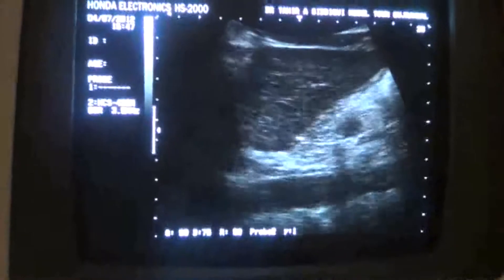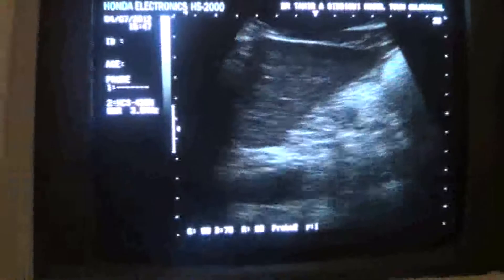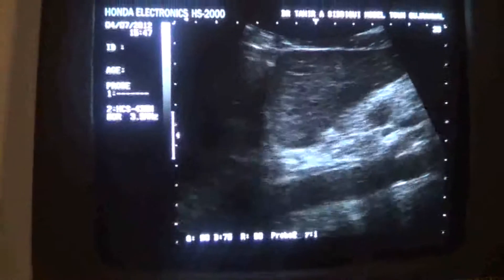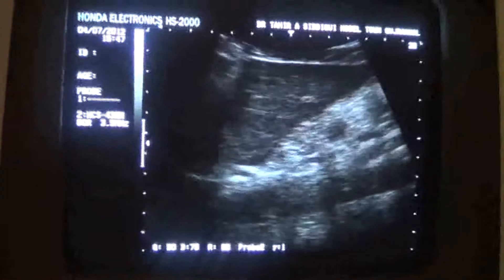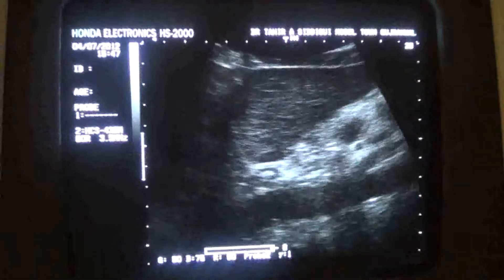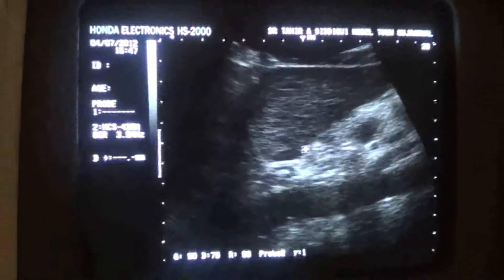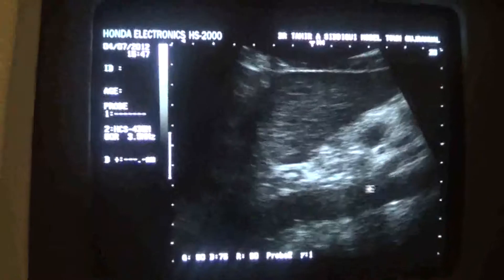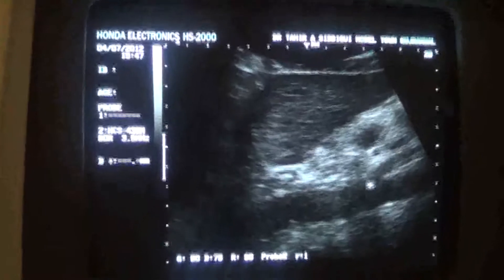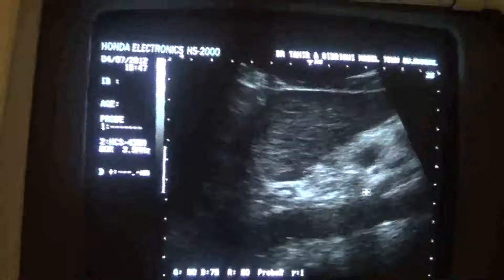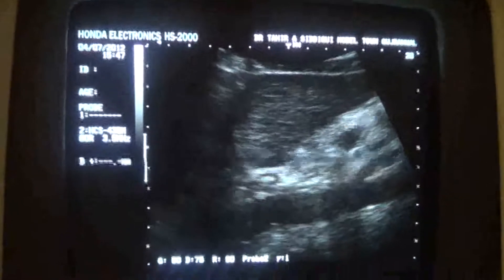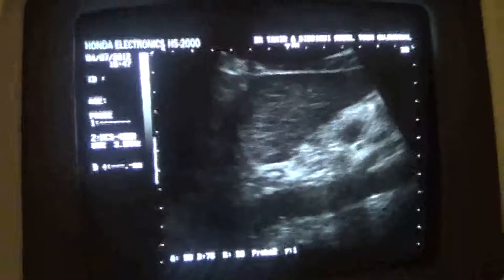I have placed the probe longitudinally in the epigastric region and at this angle we can see the aorta in longitudinal section, the superior mesenteric artery, and this is the pancreas — the white band that you are seeing.